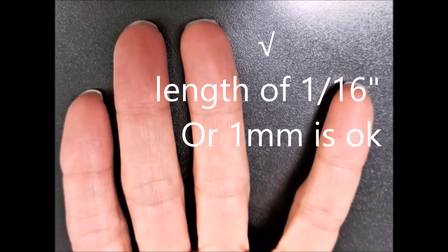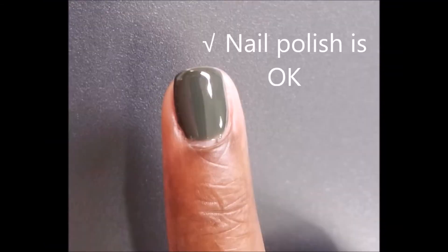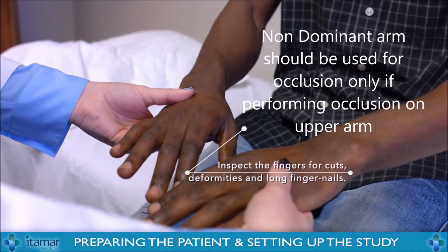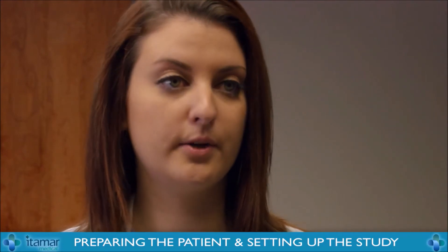Can I see your hands, please? Can you please tell me which arm is your dominant arm, or which hand you write with? My right arm. So we will be using your left arm for the part where we block your blood flow.